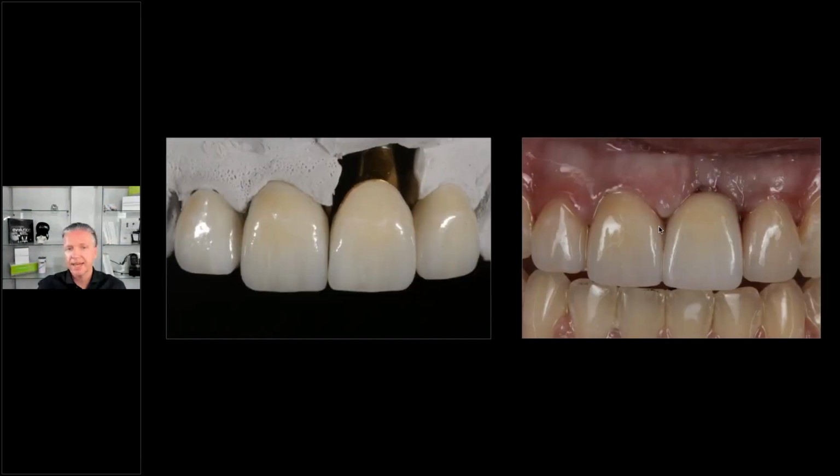A case like this, I can still cover metal custom abutments. Now you can say, oh, it's gold colored, it helps, right? Yes, it's gold colored, but still the material helps to cover the metal, because I found out over time that anodizing or making an abutment gold doesn't really help a lot, to be honest. Metal is metal, and it will always show to some degree through the tissue if the tissue is very thin or the material chosen over it is not blocking it enough. So that's a lithium disilicate case as well. The 7 and 10 are veneers, and 8 and 9 are crowns, also a GC LiSi case. Here I used MT, and MT was enough to block out that gold colored abutment from underneath.